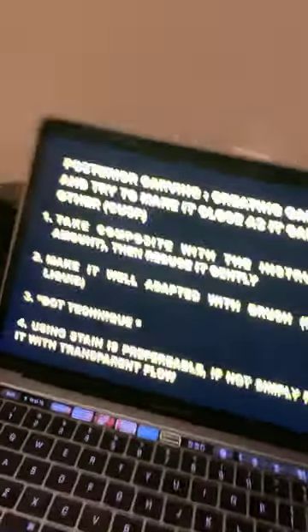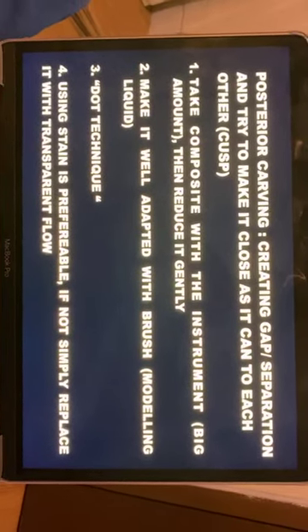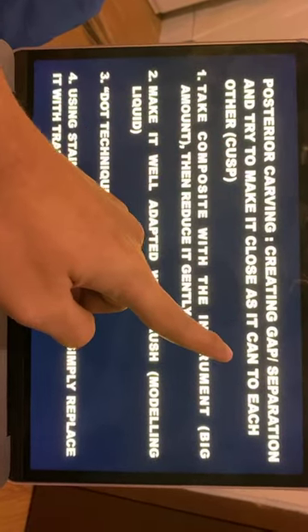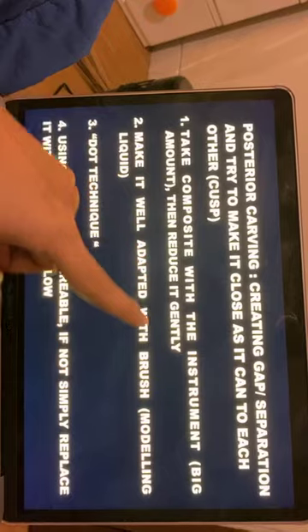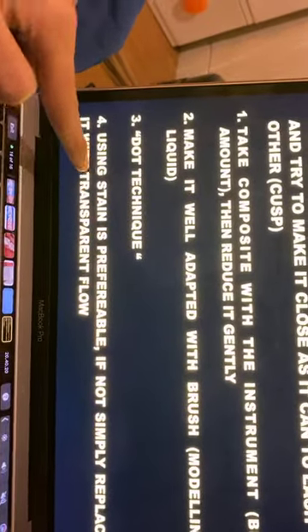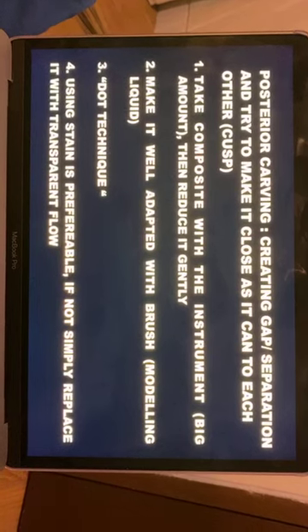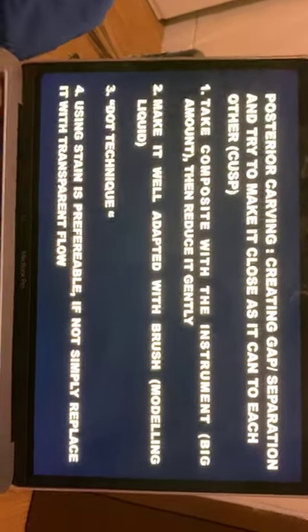Just remember, I have a summary here. I already wrote it for you. You can take a screen picture here. This is very important. This is a summary of my lecture here. Posterior carving is only about creating gap separation and trying to make the gaps close to each other. First step, take composite with the instrument, a big amount, reduce it gently, make it well adapted, brush, remember the dot technique. And using stain is preferable. If you're not using stain, you can use transparent flowable. Done. Okay, take a screen capture maybe. Remember, this is our summary. Please make a note. Just understand this.